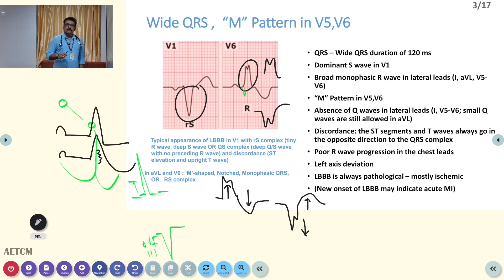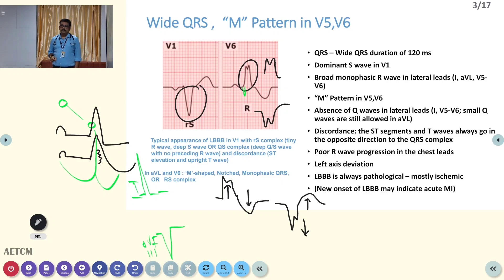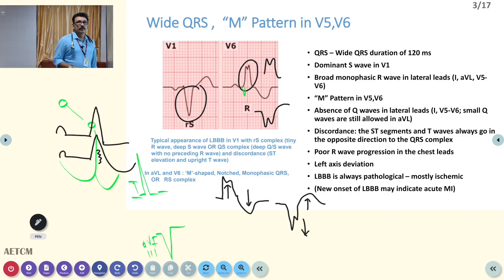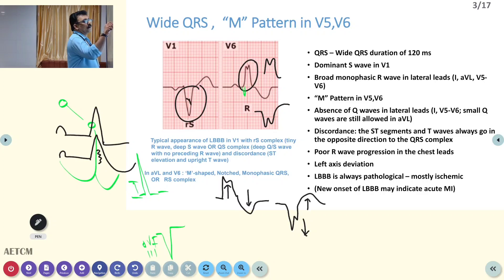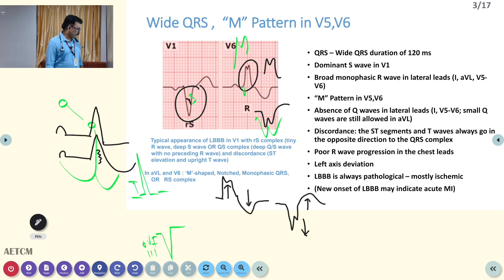LBBB is always pathological, and a new onset of LBBB is equivalent to myocardial infarction. In the ECG pattern shown here, V1 has a prominent S wave — an RS pattern — and V5, V6 have a prominent positive wave, that is the M pattern. Sometimes you can also see the W pattern.